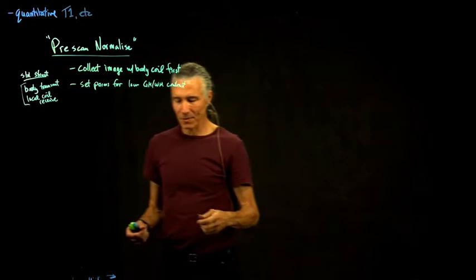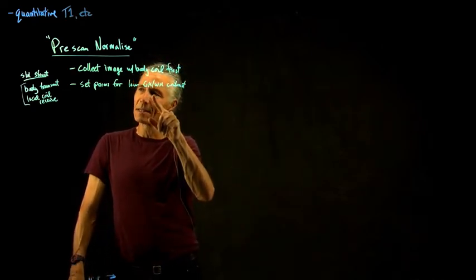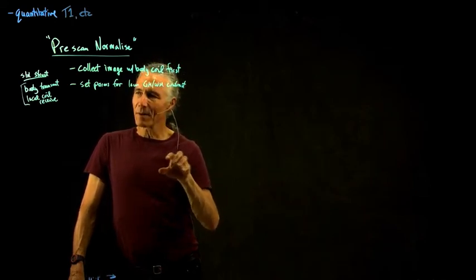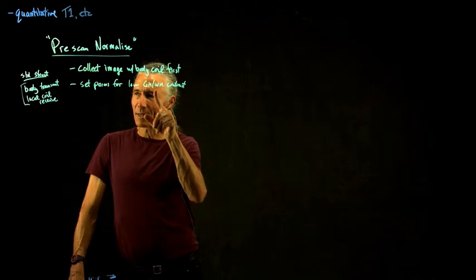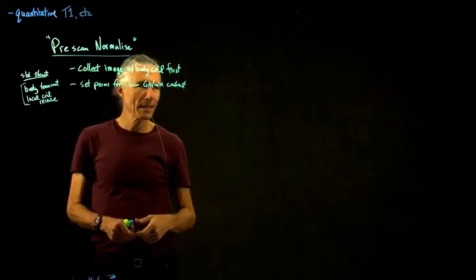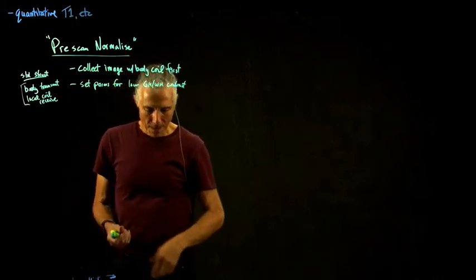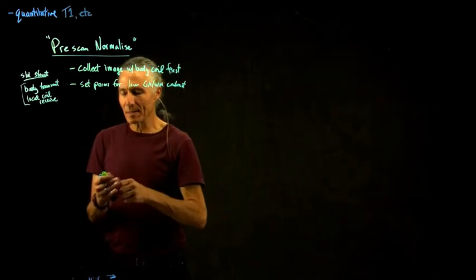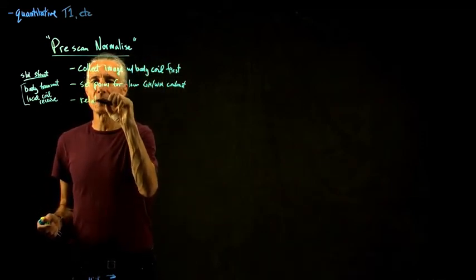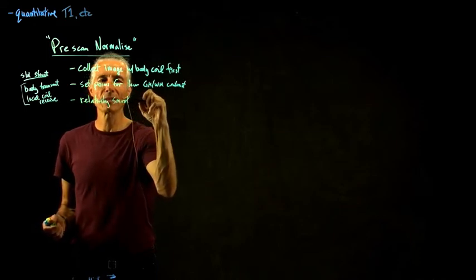So the idea is if you had high gray white matter contrast, then as you go to different parts of the brain, the signal varies, but some of that could be from gray white matter contrast. So if you just do a scan that has low gray white matter contrast, then that's how you could more easily estimate what the fall off is. And this is relatively smooth. So that's good. So we don't have to do a high resolution scan.